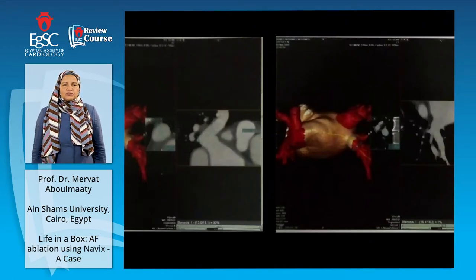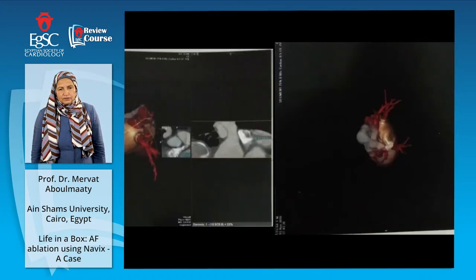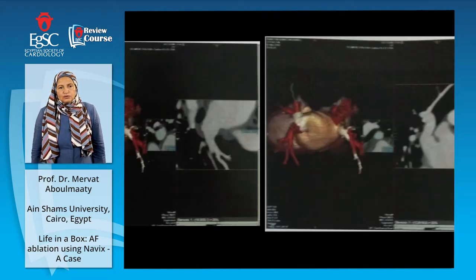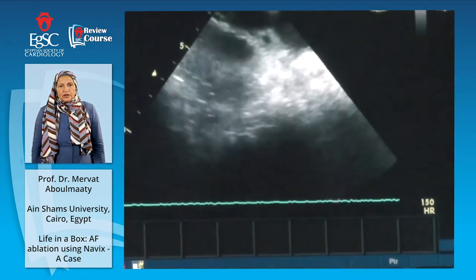And fortunately, we have a very good CT image for this patient. And in this image, we check for the veins, we check for the left atrial appendage. And we make cuts through the Navix machine. And we take the left atrium and the 4 pulmonary veins into the machine.